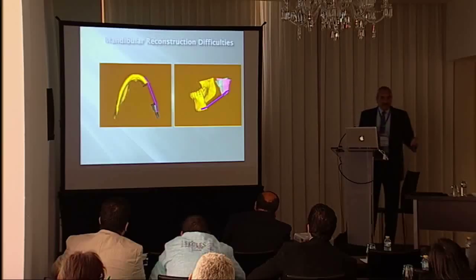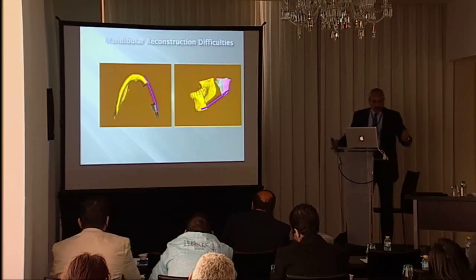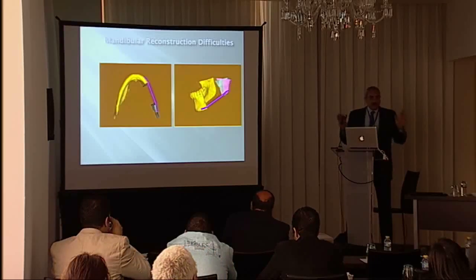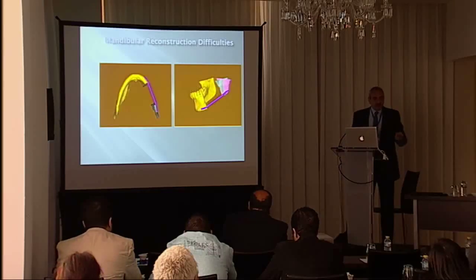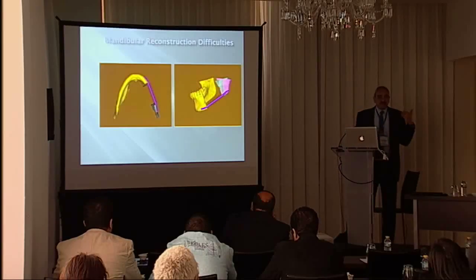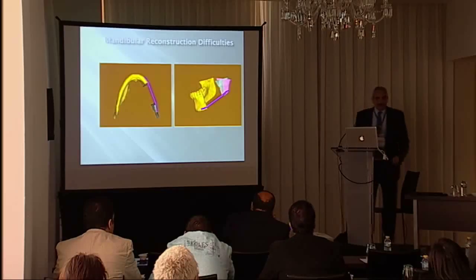So we were used to do that with the use of two plates. We bend one plate on the bulgy mandible, then we resect the mandible and fix it to position with the first plate. Then we use another plate where we bend it and place it to the position we need. Then we take the first plate out and throw it away. And this consumes a considerable time in the operating room.